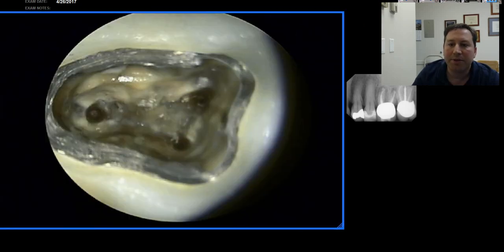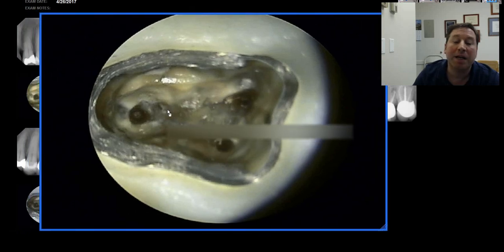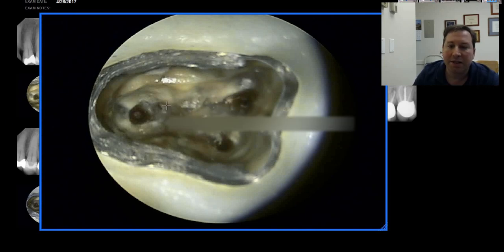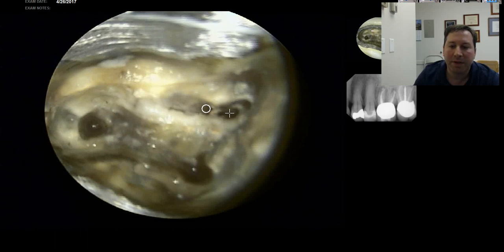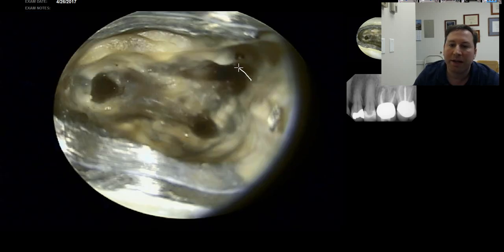As we go through sequential images of us cleaning up the tooth, you can see here the shape of the orifices becomes even more evident as circular. We had to clean up a huge amount of calcifications on the floor of the tooth that had not been properly removed. And here we can actually start to see the outlines of that MB2 starting to form over here. Third sequential image here, we can actually see those two orifices more fully opened up. And those two actually ended up joining.